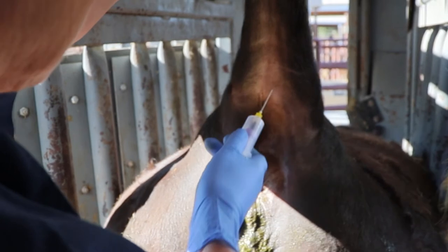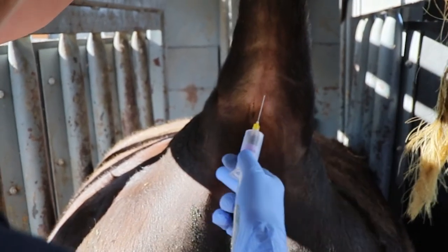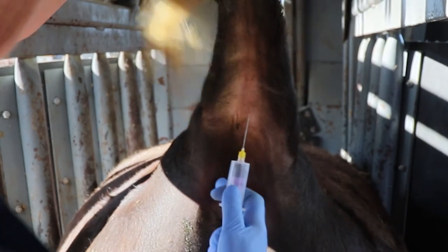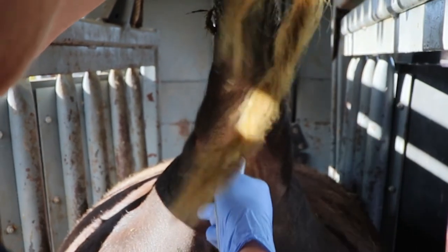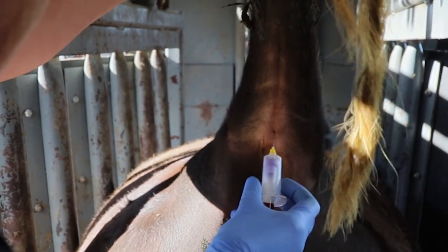Here is a different view. So again, you don't want to come in at an angle. You want to insert the needle as straight as possible, avoid the vertebrae, pop the tube on, and then it should fill pretty quickly if you're in the right spot.